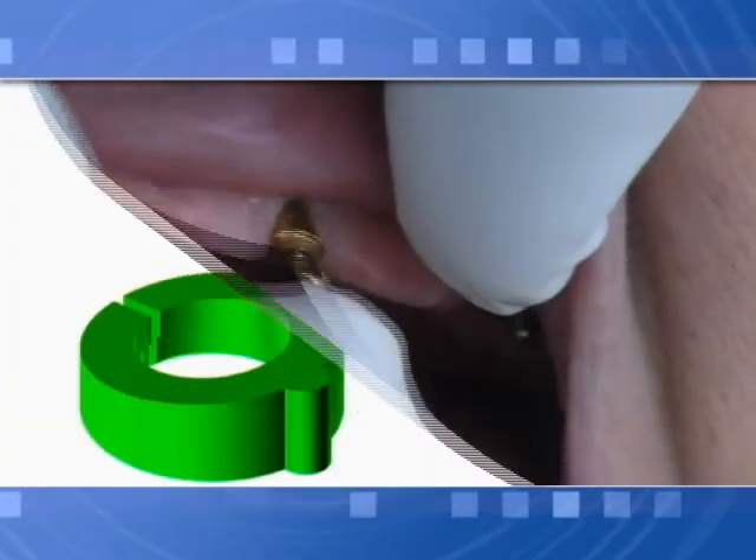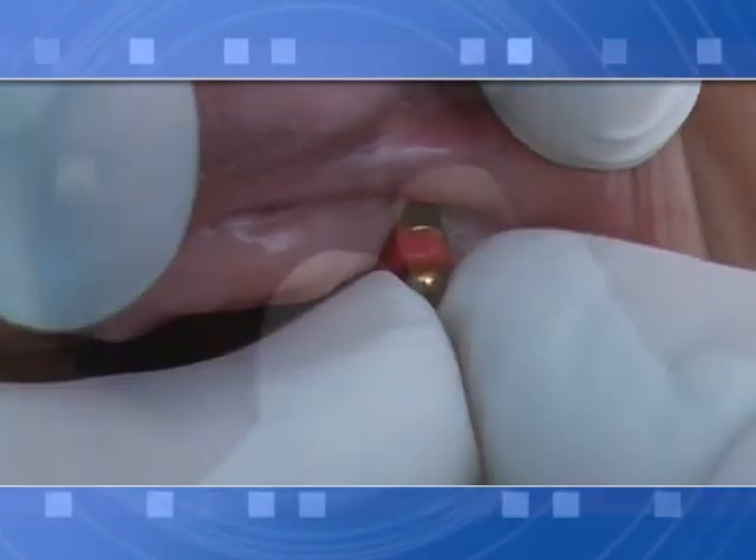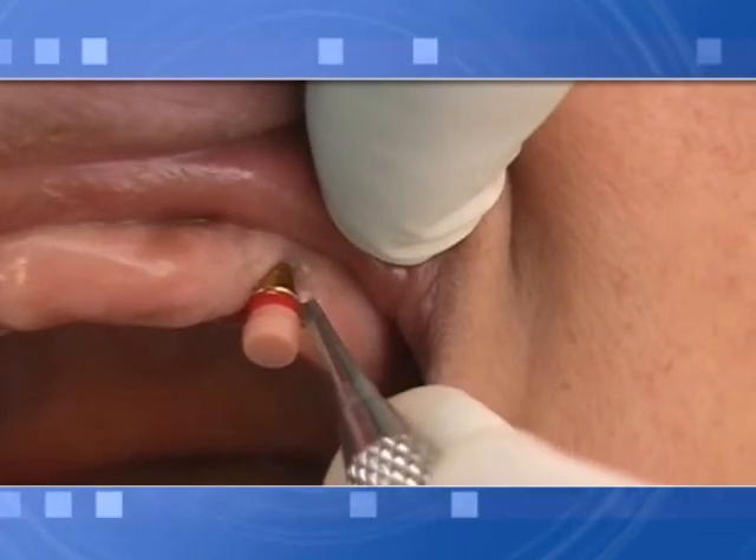Set the directional ring over the sphere, finding the right connection side to the hexagon. Insert the rotative cap and rotate the ring using a pointed tool until a parallel position is set among all caps.